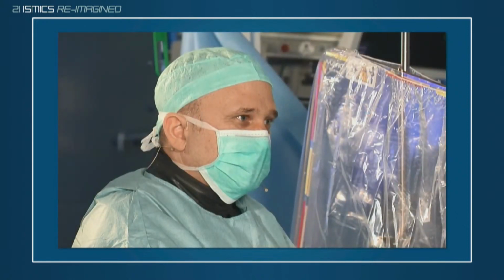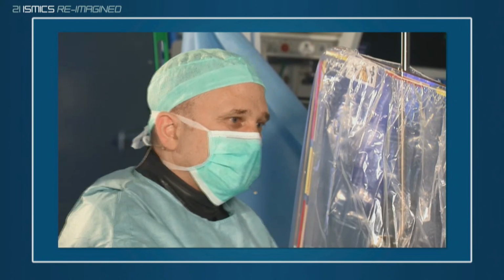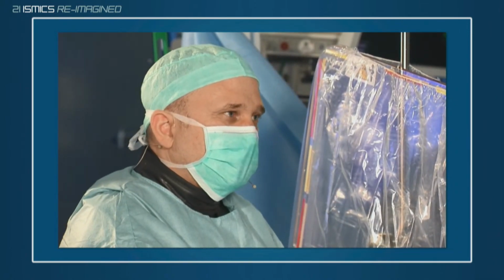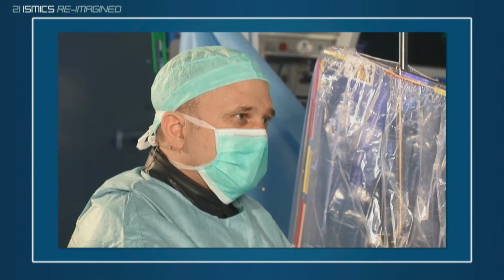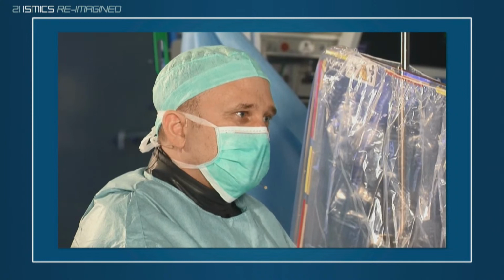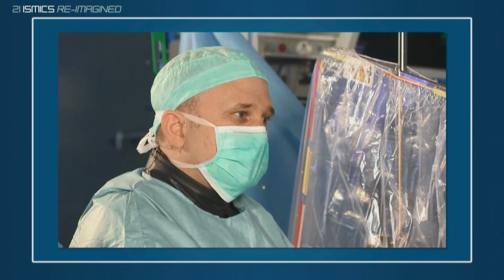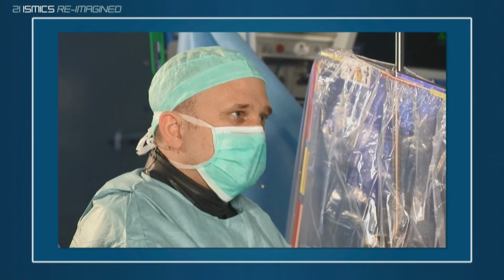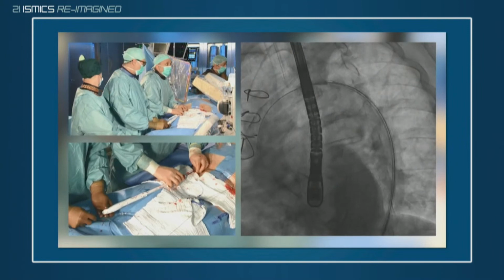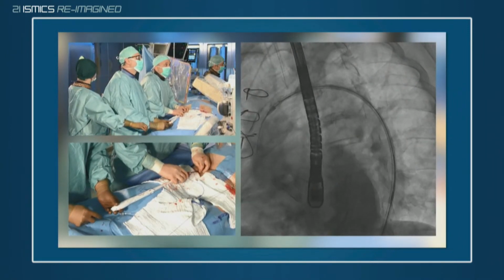Of course, we are facing some kind of PPM in this patient, but I think the main problem is deterioration of the bioprosthesis. The patient did very fine for many years, and a couple months ago, suddenly she became symptomatic. So I would assume that it is more the aspect of deterioration than of existing PPM. And the next step is we are going to introduce the TriGuard system for cerebral emboli protection.